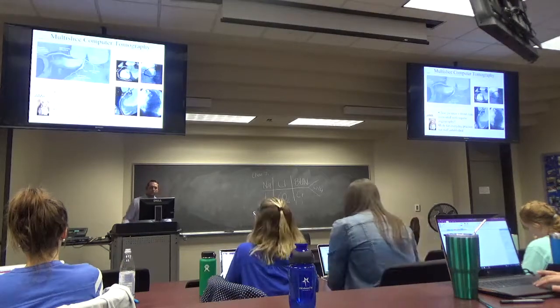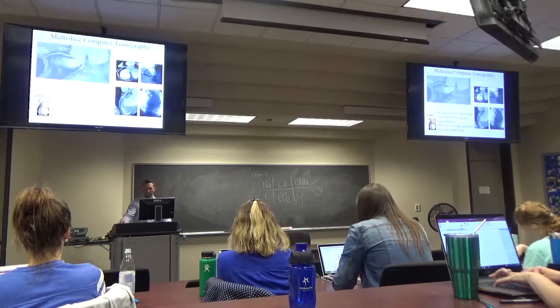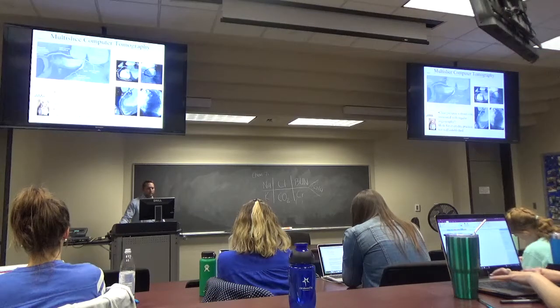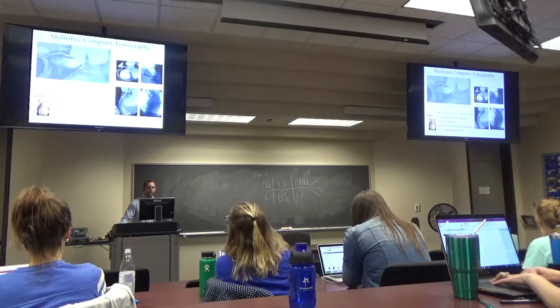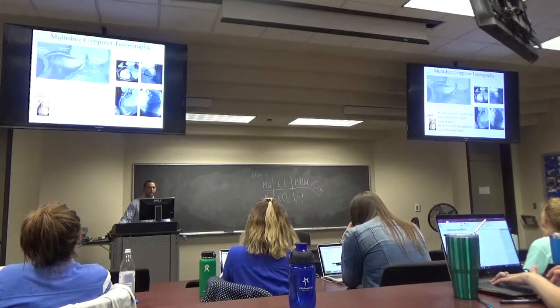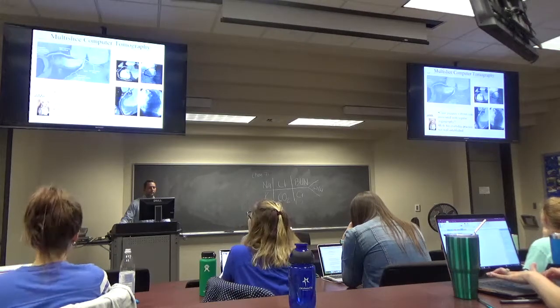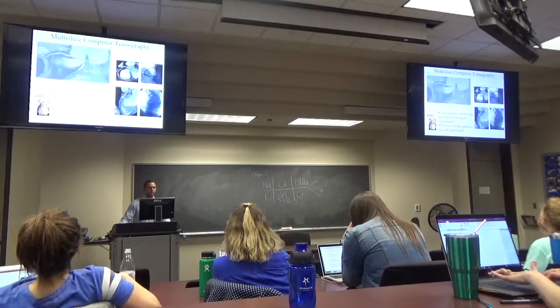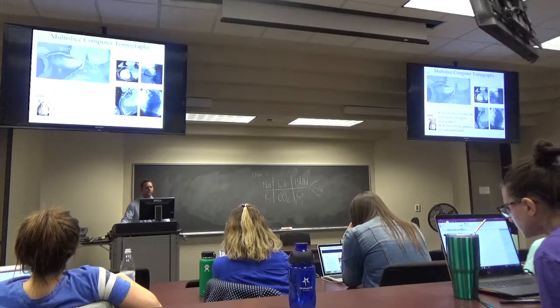And this is multi-slice computed tomography. This is basically CT. With CT, you get really, really good spatial resolution. As you can see here, you see this RCA coming off the aorta. Remember, this is the front side of the patient, this is lateral, this is posterior, and this is medial. So here's the RCA coming off. There are little tiny stenoses, there's a stenosis right off the RCA, here is some more stenoses, and then you can see stent placement over the LAD, the left coming off right here. So you get really, really clear pictures off CT.